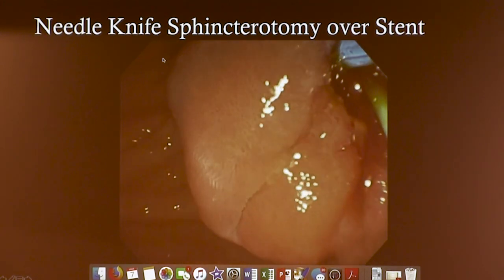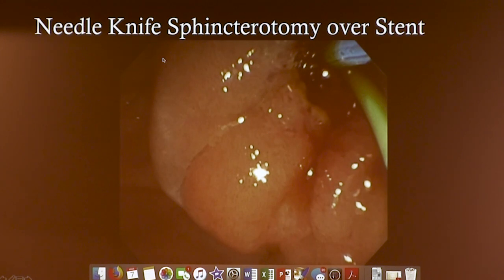And again, I think when you watch these videos at DDW, these people always show these impressive videos of how easy it is. I think in real life, sometimes it can be a bit scary. It starts really easy. You think it looks like a great, nice intraduodenal segment of the bile duct. You start cutting, and all of a sudden you start losing your planes.